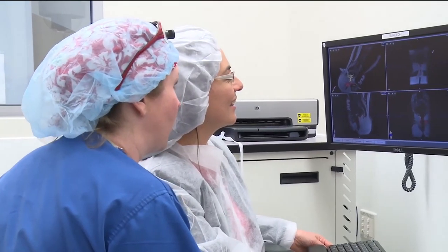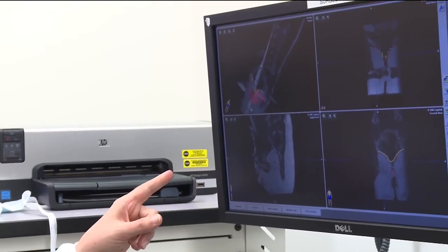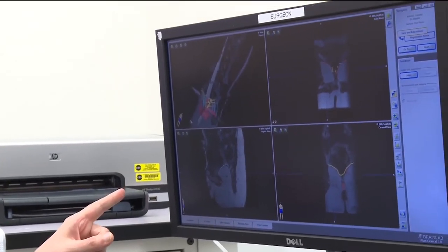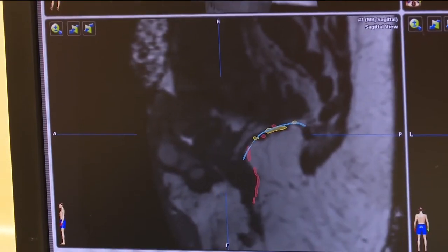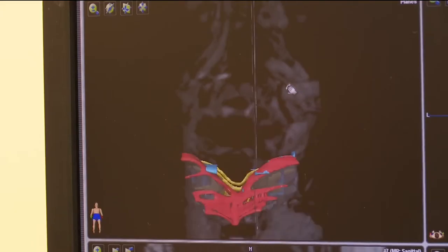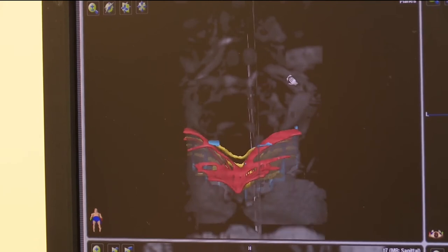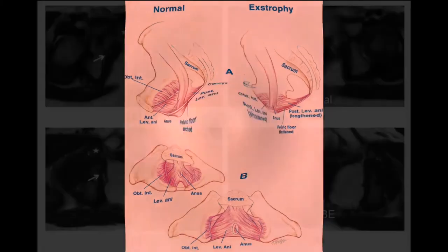The pediatric urologist and the pediatric radiologist sit and do intraoperative pelvic MRI planning prior to the procedure. Using the iPlanNet BrainLab computational system, bony pelvic anatomic landmarks and the pelvic muscular anatomy are drawn on the MRI.